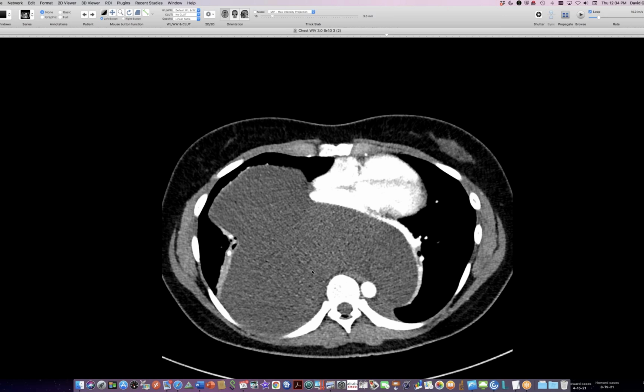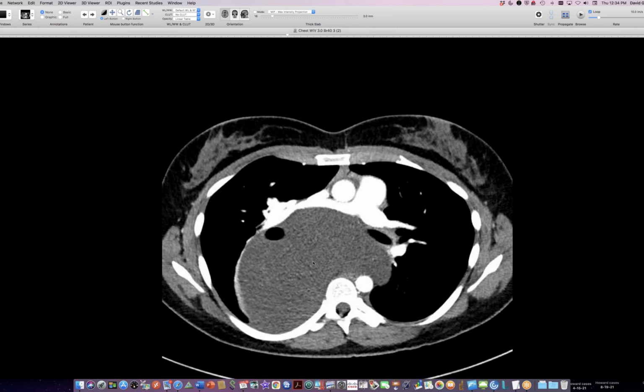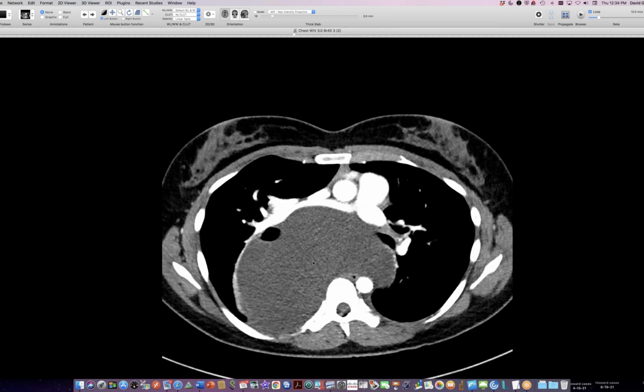So what I wanted to be a chordoma turned out to be a disappointing lipoblastoma, but that's not a bad thing because I've never had a case of lipoblastoma before. So can you please everybody mobilize your lipoblastoma cases and show them to me. I've never seen one before. Has anybody else seen a lipoblastoma? Never. In an adult, yeah. I mean, I lecture on them at the ARP, so I have a bunch of cases, but they don't look anything like this. They're usually fatty lesions in the neck or in the superior mediastinum extending from the neck or in the arm. I've never seen one look like this.